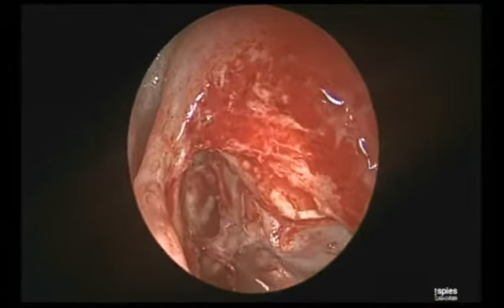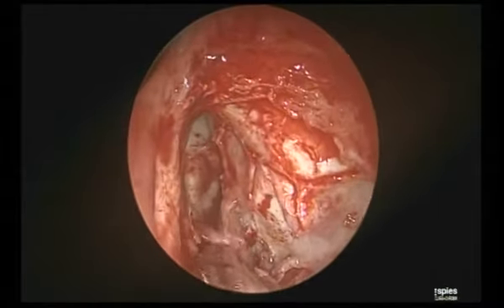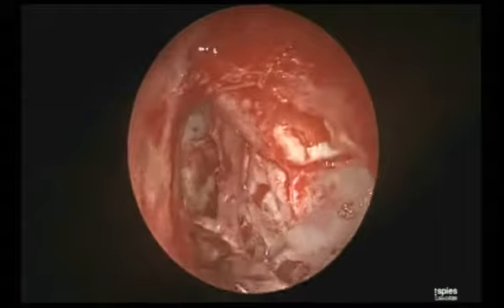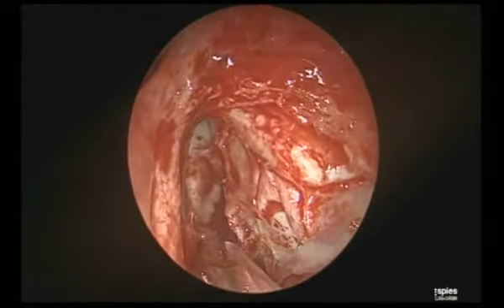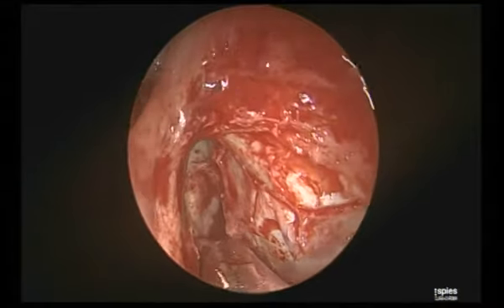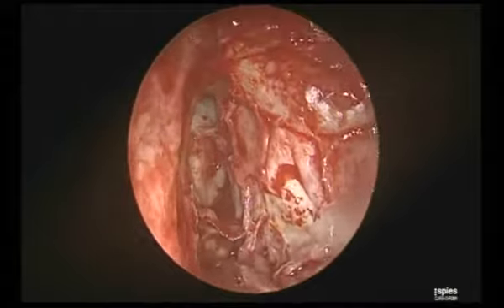Anyway, I am not going to press upon the lamina. I told you the strategy: the debrider should go close and the angle should not be facing the lamina. Don't press it on the lamina. Debrider is a great tool, but it can be hazardous if it is not used properly. Your cutting edges should be under vision, under close-up all the time.